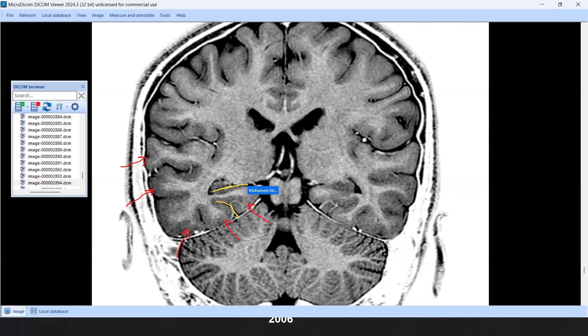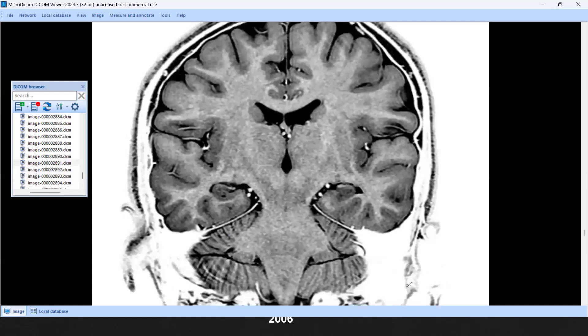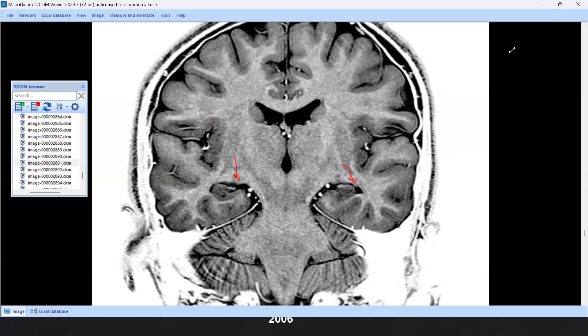We need to note that there is no volume loss between right and left, and the temporal lobes appear symmetric. This is in brief what we have covered. Thank you for attending this part. Let us move to the second part where we will look at examples of temporal lobe epilepsy.